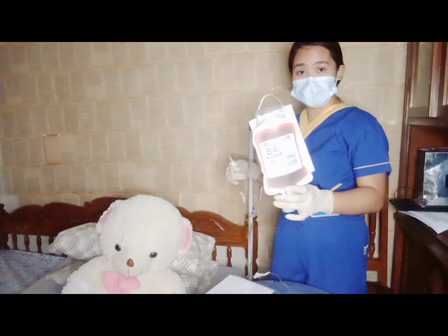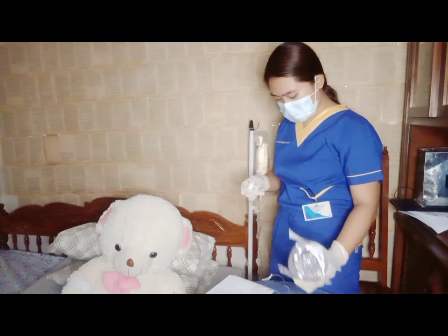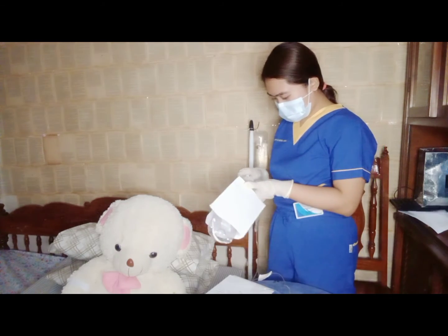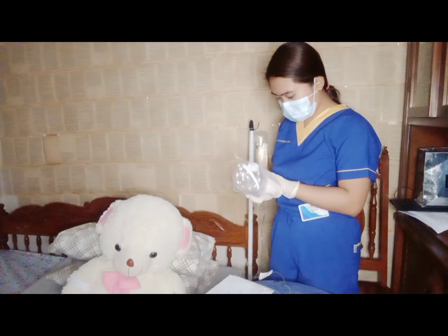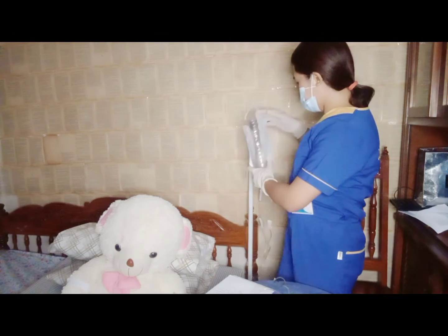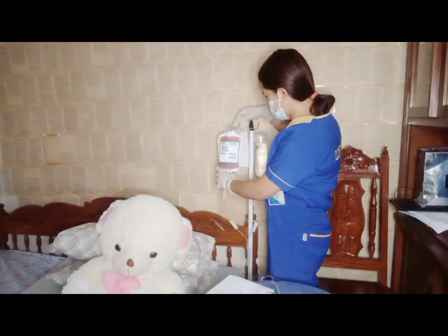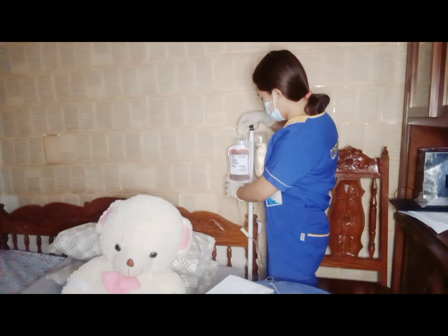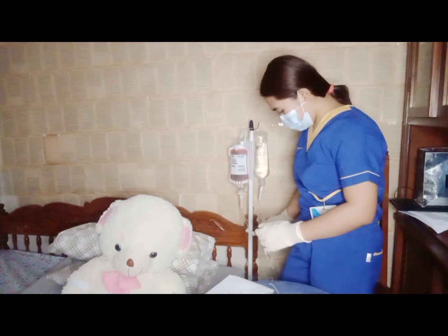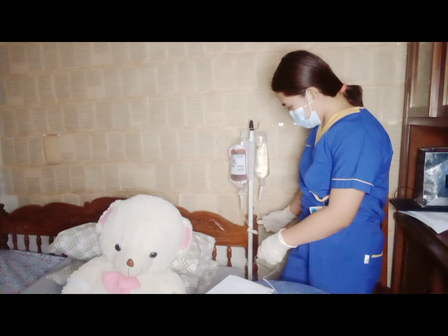So here is our blood product. Open the clamp to allow the blood to flow.